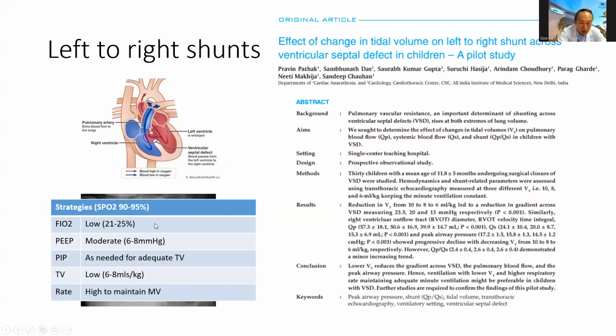But of course, if the patient is stuck on positive pressure for 1 month and you are unable to achieve much diuresis using medical means alone, as you continue to ventilate these patients, you see that the oxygen requirement increases. PEEP, as we discussed earlier, reduces the amount of blood flow to the lungs, hence able to keep the lungs a bit drier and helps with reabsorption of the fluid as well. So we usually keep the PEEP at moderate levels.